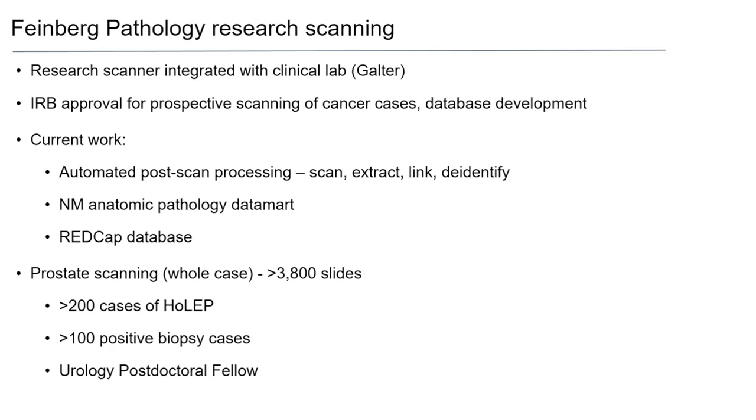Yeah, I mean, it's really all about automating those steps after the scanning to get that data set. And I think we know how to do that. It's just a matter of putting the work in and validating. And if we're doing this prospectively, we have a big advantage in that the new slides all have barcodes, and so we can read that barcode and then talk to the pathology data mart that's coming online soon, and then do all that linking and pull all that structured data in. So the goal would be to get this to the point where the actual scanning of the slides is the bulk of the work, even though that's very easy.